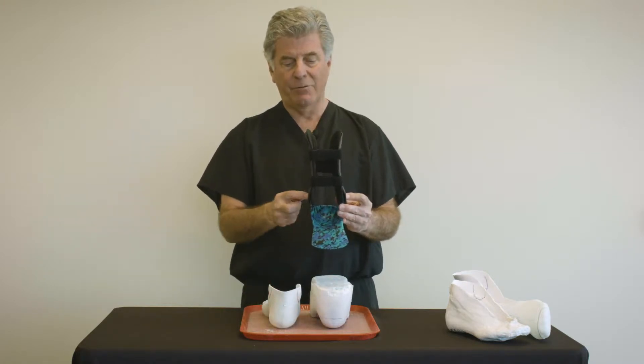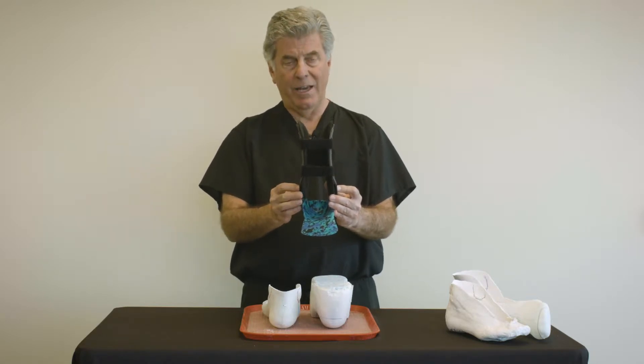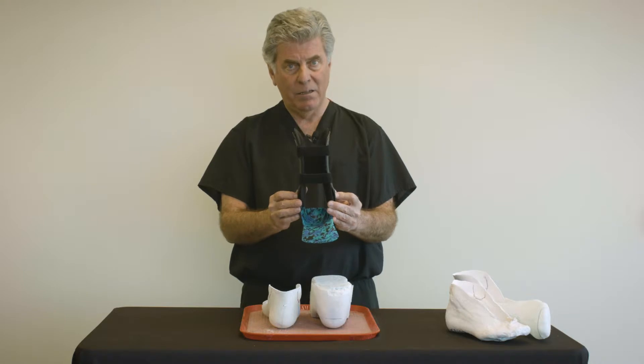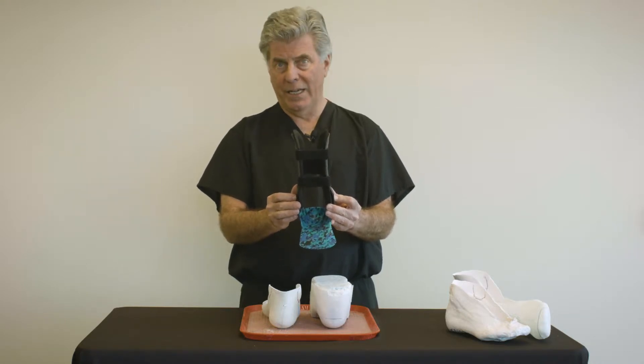The cast must accurately capture the true anatomy of the patient's ankle anatomy, lower heel anatomy, and lower leg anatomy.